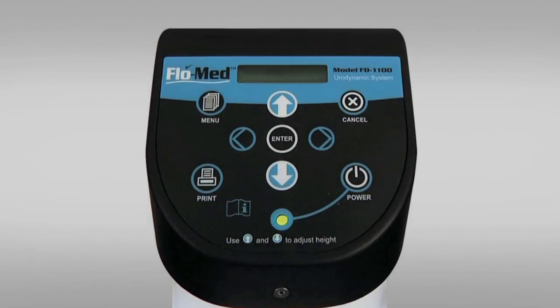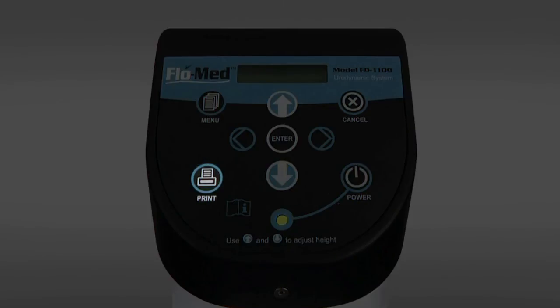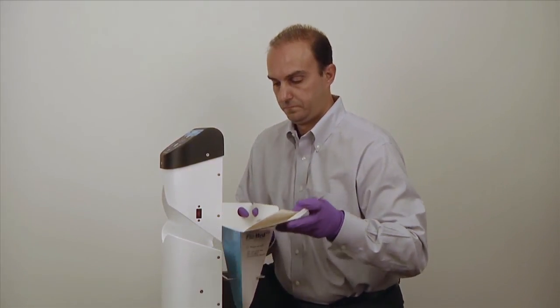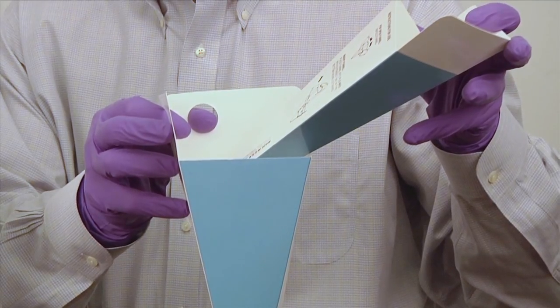The FlowMed will keep the latest test result in its memory until the next measurement is taken. To print the latest result, press the print button. The used funnel and collection cup can be removed after the flow measurement is taken. To eliminate dripping, remove the funnel and cup sideways as shown and dispose in trash.